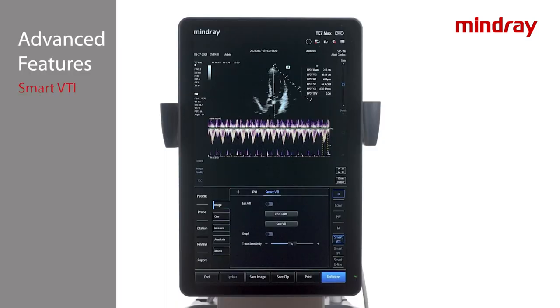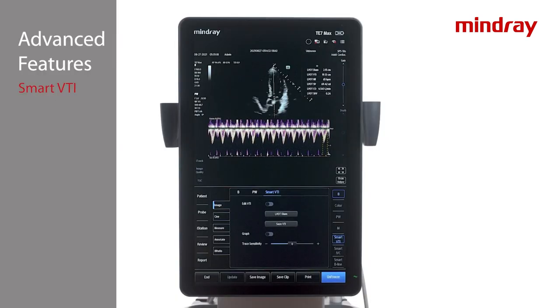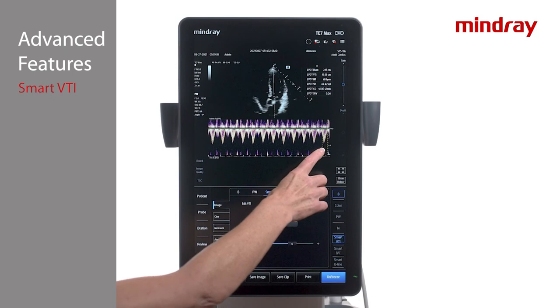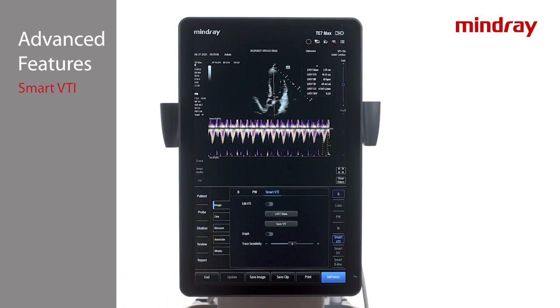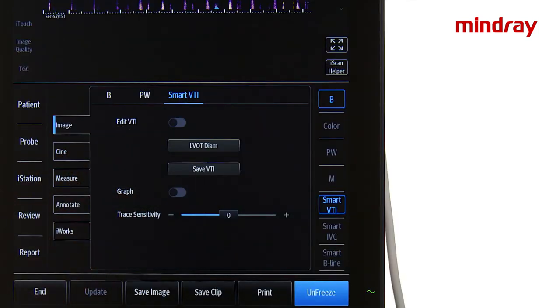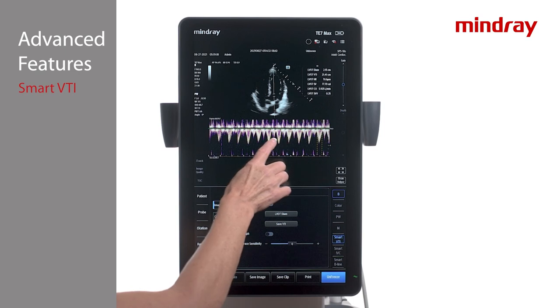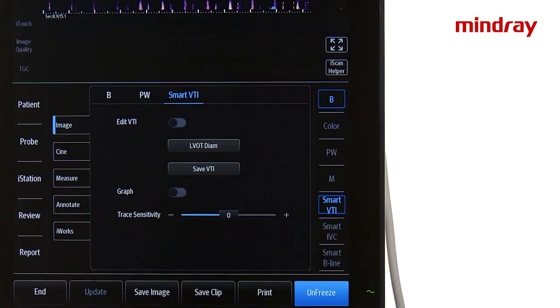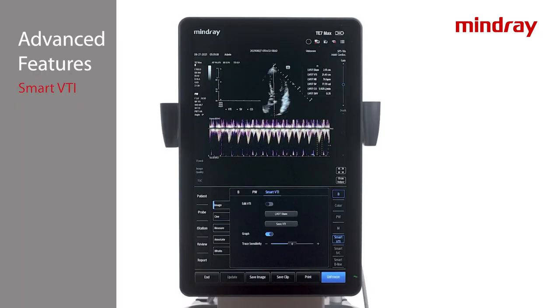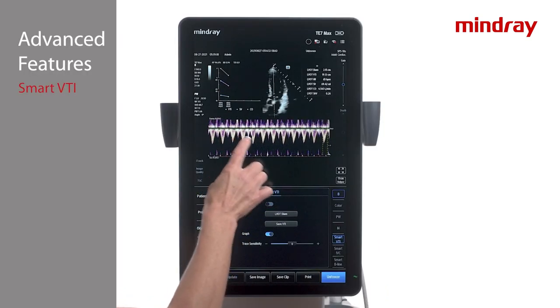An LVOT diameter is necessary to calculate stroke volume and cardiac output. If it was not manually measured earlier, use the LVOT diameter tab to enter a numeric value. The Doppler envelope being used for the displayed data is the last one to the right, indicated with dotted lines. Scroll to a different complex if this one is suboptimal, or manually adjust the trace with the Edit VTI tab using the caliper tool. By turning on the graph and tapping Save VTI, the system can plot multiple data points for the patient. The data from Smart VTI can be found in the fluid management report type.